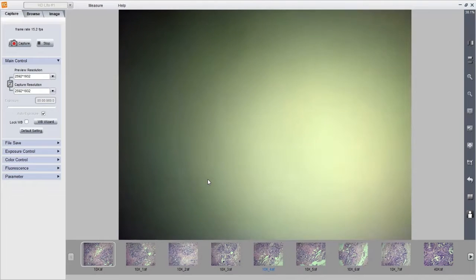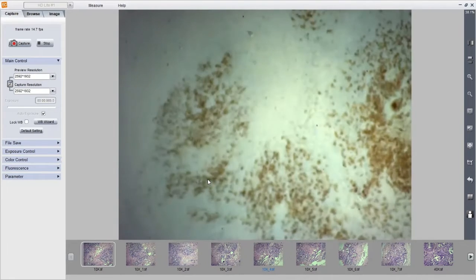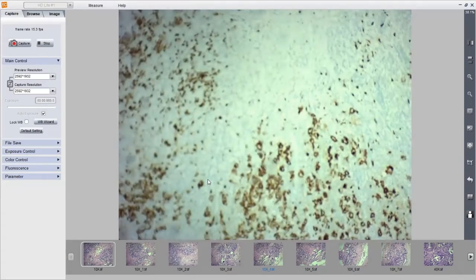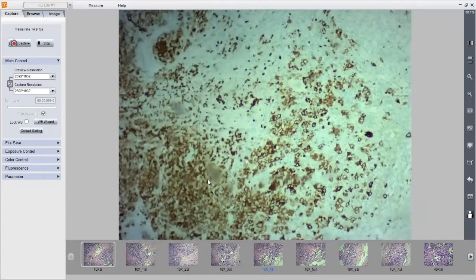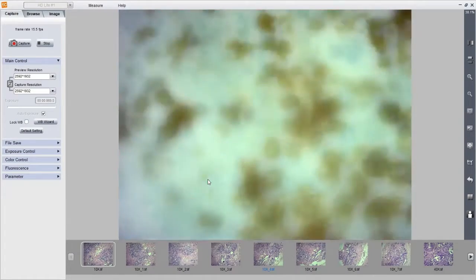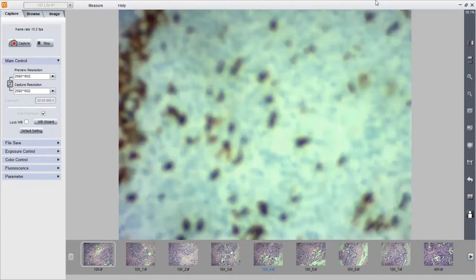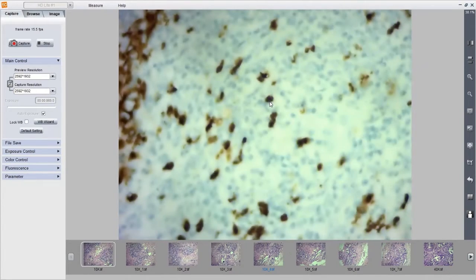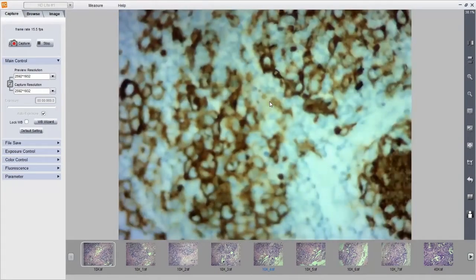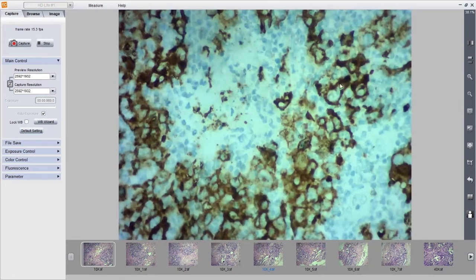Now CD15. Yes. So what are the normal cells that take up CD15? As I told, neutrophils can take it up. So we have a nice control of small neutrophils or myeloid cells, which are positive for CD15 here. The size is very small. And what about the large cells, the cells which we were thinking of as the Hodgkin cells? They're positive for CD15, very nice, brightly positive. So this cell is showing aberrant CD15 positivity.